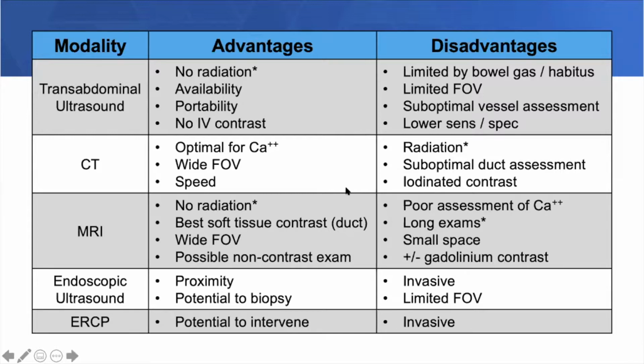When you think about CT versus MRI, one of the big advantages of CT is your spatial resolution, generally, and the fact that you can see calcification. So that's particularly important in adults when you're dealing with calcific chronic pancreatitis, looking for those calcified stones. Less important in pediatrics, but you will miss calcifications by MRI. In fact, they can often be invisible. CT also has a big advantage of speed. So if you need cross-sectional imaging in that critically ill patient, that patient doesn't belong in the MR scanner. Get that CT scan done and get them back up to the ICU, particularly if they're sick.